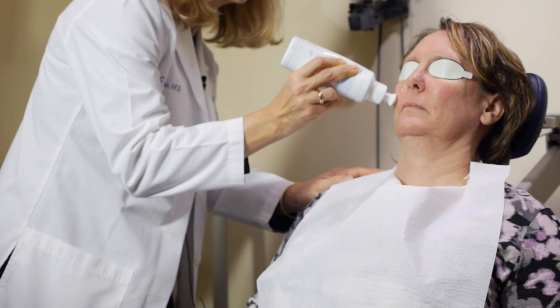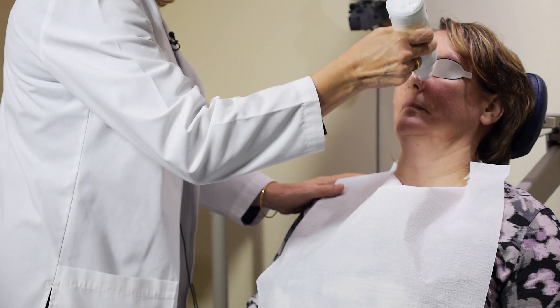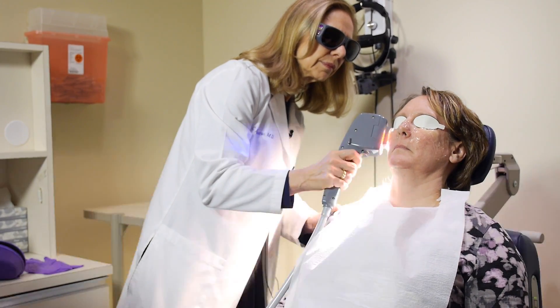The procedure for the IPL is simple. It's done in the office — the patient drives to the office. The key is not to have makeup on and not to be in the process of tanning at the time we do the IPL. We apply a numbing gel on the lower eyelids, then we put a gel over the face and perform the IPL. It's a series of lights that we pulse along the lower lids, and then we wipe the gel off. The whole process takes about 10 minutes or so.